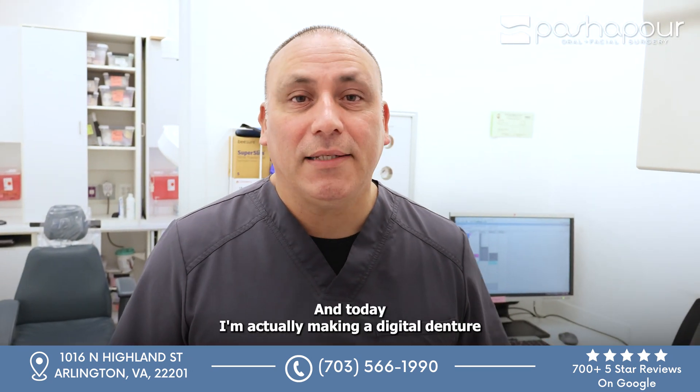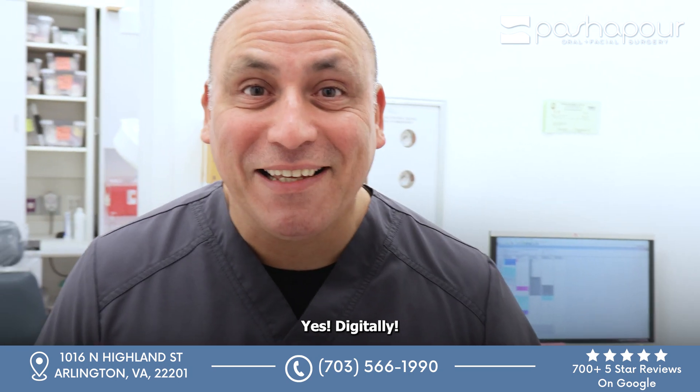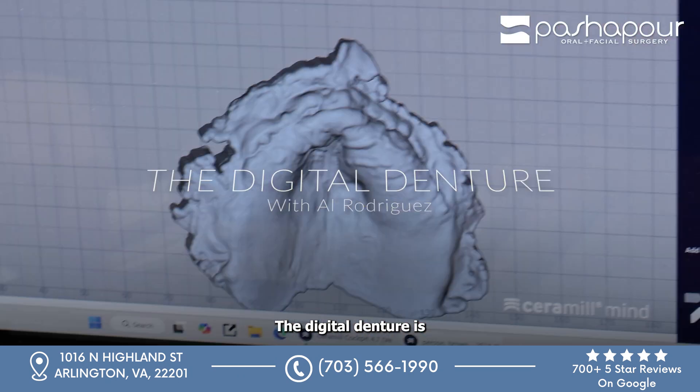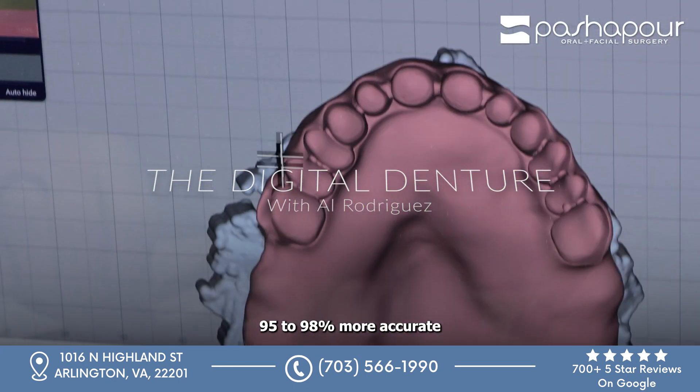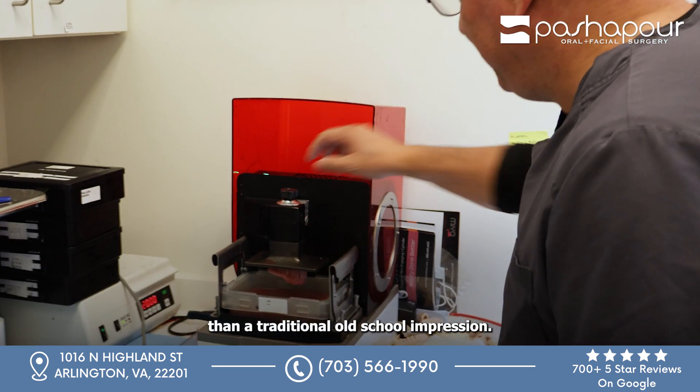Hey, I'm Al Rodriguez. I'm actually Dr. Passport's Lab Tech, and today I'm making a digital denture — yes, digitally! The digital denture is 85 to 98% more accurate than a traditional old-school impression.